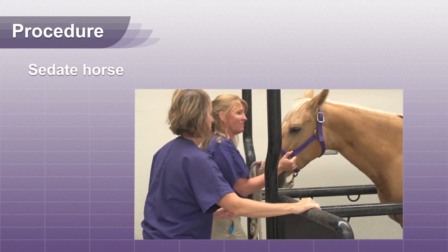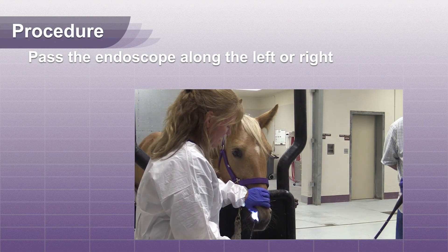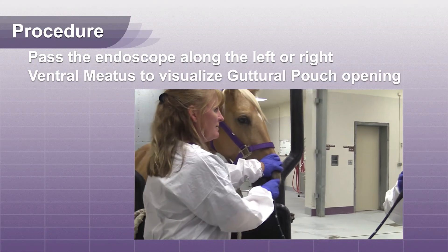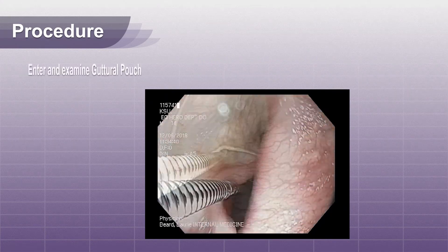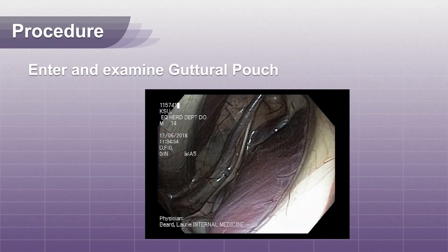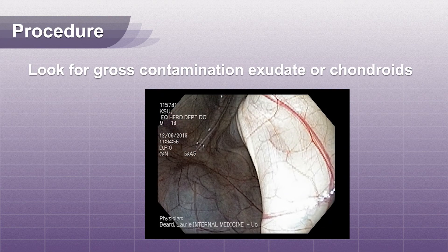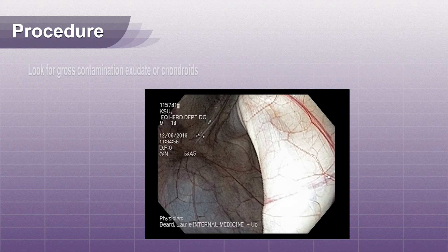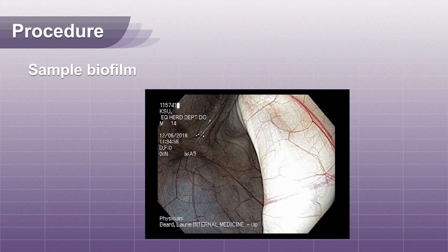The horse should be sedated to allow for placement of the endoscope. Pass the endoscope along the left or right ventral meatus until you can visualize the guttural pouch opening. Enter and examine the guttural pouch. Look for gross contamination, exudate, or chondroids. If these are present, remove them and treat the guttural pouch. Even if the guttural pouch looks clean, the biofilm can harbor the strep equi organism and should be sampled.